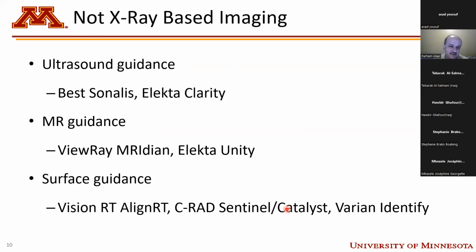And then there's the surface guidance. There are 3 devices out there right now, and these are becoming more popular, at least in the US. I know part of Europe uses it quite a bit, and oftentimes we utilize them in combination with X-ray based imaging systems, so we have a multimodality imaging type of patient motion management.